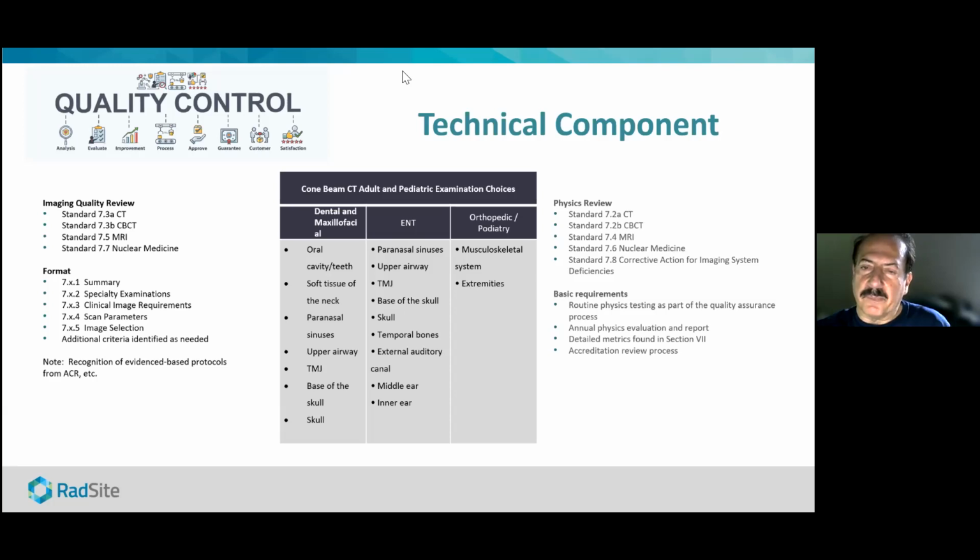If there's a difference in opinion, even about the images, that information from the expert will be conveyed back again. If there are ways to improve the quality of the image or slice thickness of the image or other parameters to create a better quality image, those recommendations are passed along also.